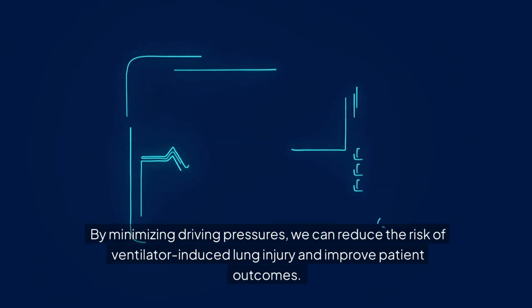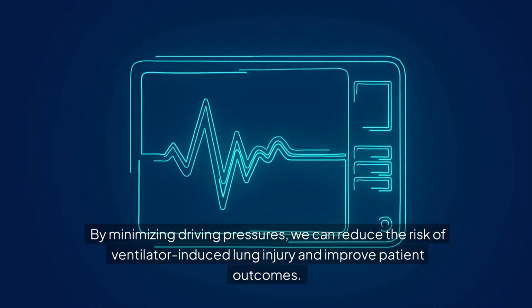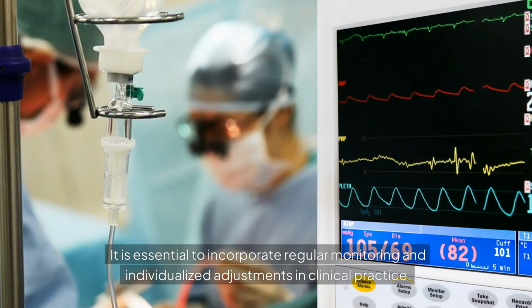By minimizing driving pressures, we can reduce the risk of ventilator-induced lung injury and improve patient outcomes. It is essential to incorporate regular monitoring and individualized adjustments in clinical practice.